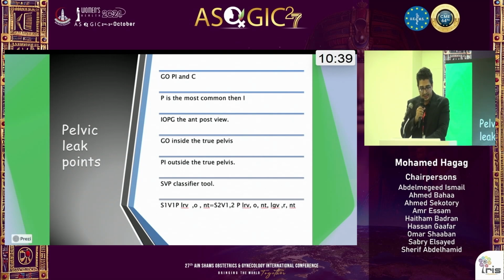And the last one is how we report these patients. For example, this means that the patient has a loin symptom with hilar varices and left renal vein obstruction, non-thrombotic. So this means it is a case of Nutcracker. This is how we report it for a standard of venous reporting.